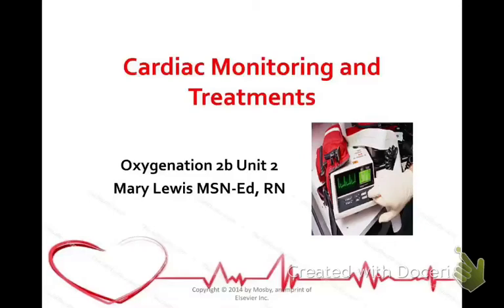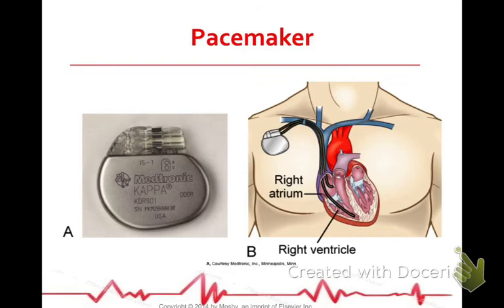A continuation. So now we're going to talk about pacemakers. Pacemakers are implanted within the body. You can see the A is the actual power source. That's your pacemaker, and it's placed with leads. You can see the wires that go down into the atrium.